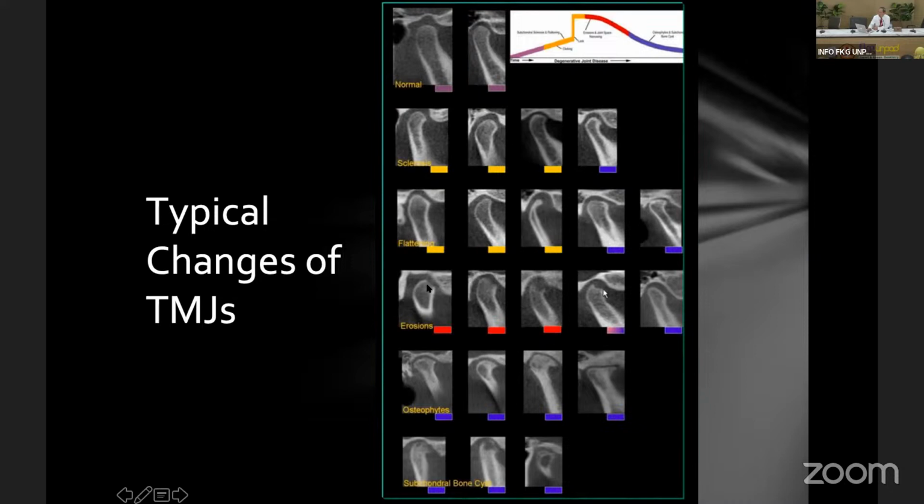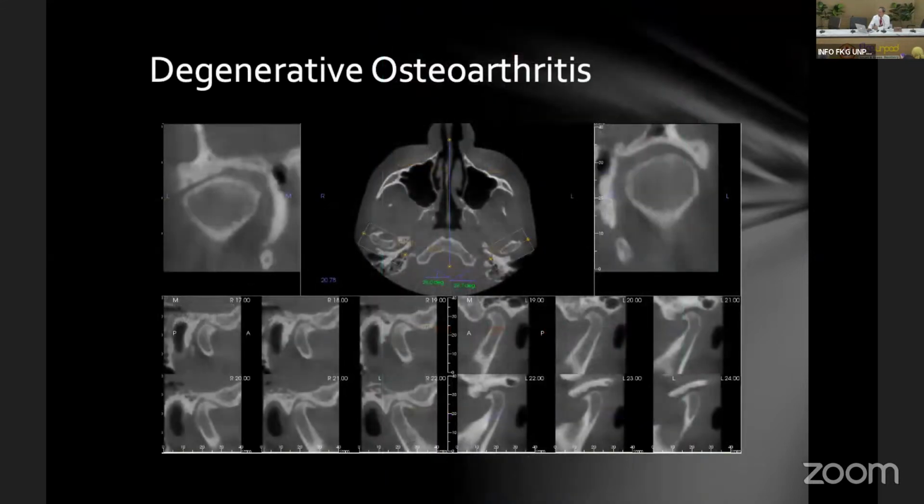And the cortical erosion, the loss of the cortex, you can also see on the cone beam. Anterior osteophyte formation, you can see here. Sometimes you can also see subchondral cyst formation like this one. Now, for oral medicine, if patients present with temporomandibular joint disease, the cone beam can certainly help you assess the bone change. This is degenerative osteoarthritis. You can see the flattening and the sclerotic change, with anterior osteophyte formation.